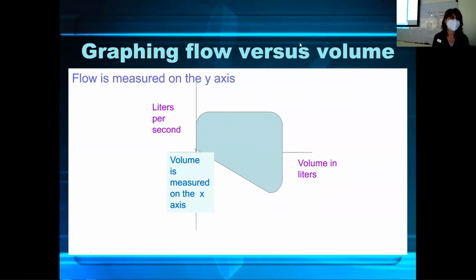Let me draw that. So here is, oh yeah, me drawing a straight line. So that's the x-axis. Everything above is inspiration. Everything below is exhalation.